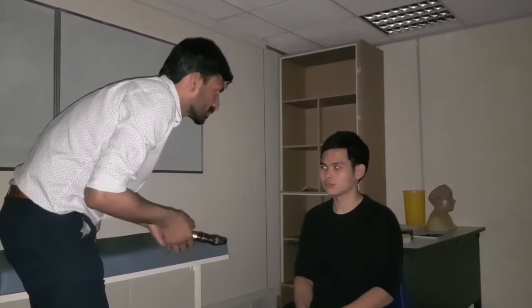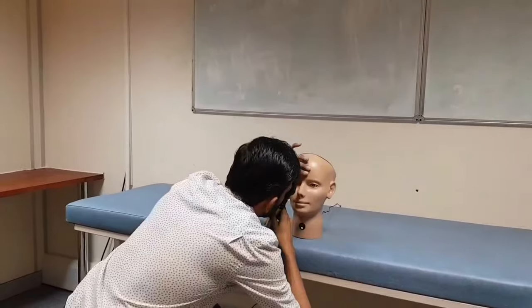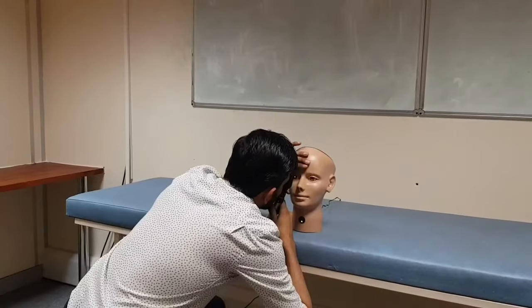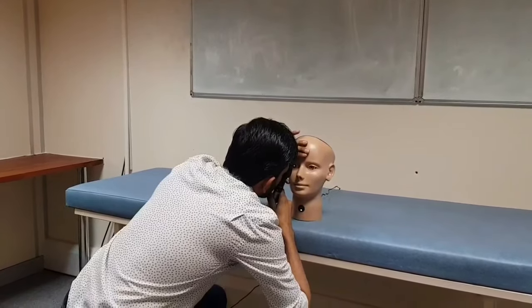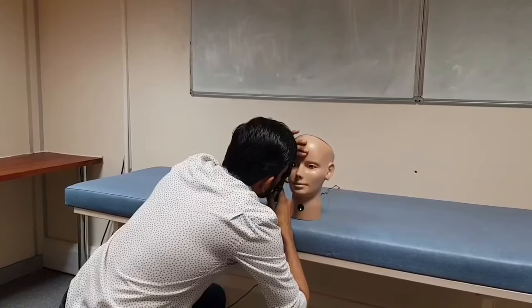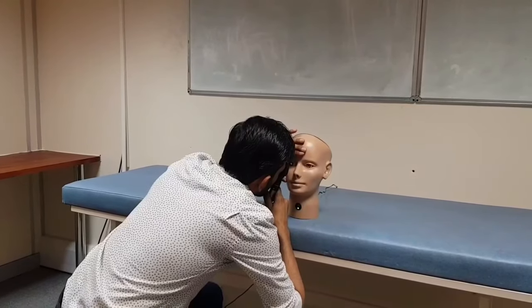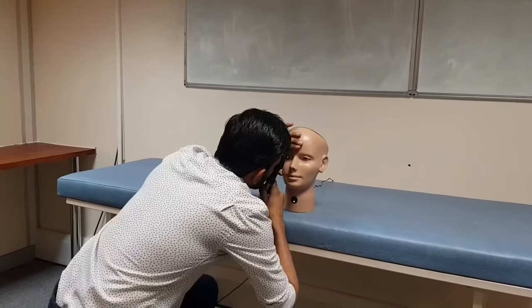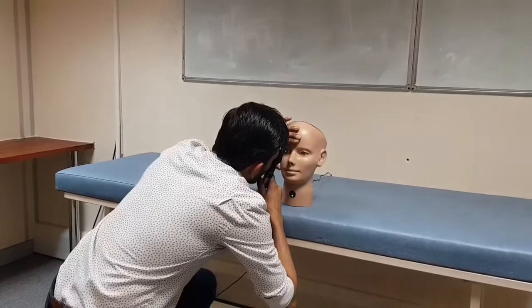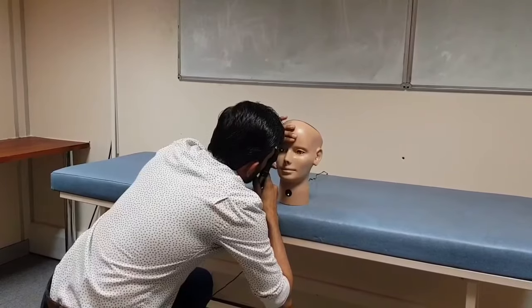Red reflex is present. I can see the optic disc. Optic disc cup ratio is normal. Optic disc is pinkish-yellowish in color. I can see the vessels originating from the disc, which are normal in caliber. They are not tortuous. Macula seems to be healthy.